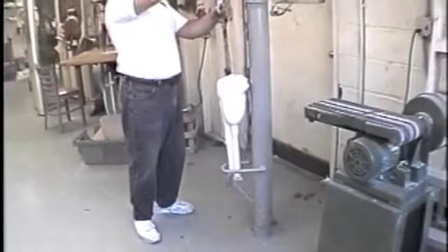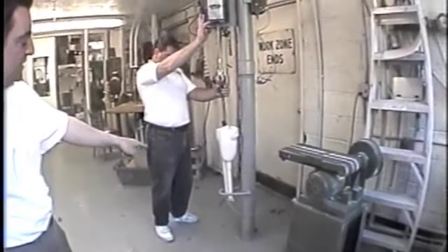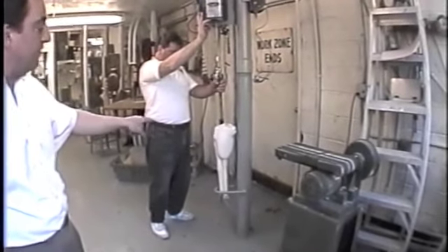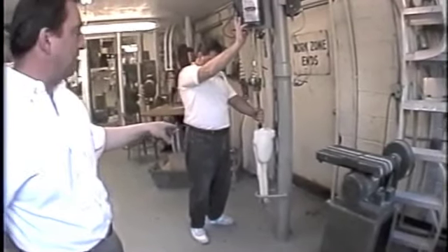Now, this is an electric winch that pulls 2 tons. That's 4,000 pounds. That's enough force to actually rip the plastic right out of the bottom. So since this model does not have an insert on it, there's going to be a lot of tension on that plaster as he pulls it.